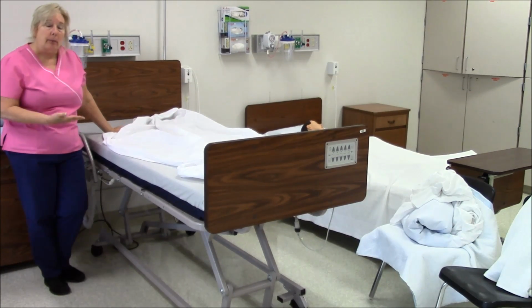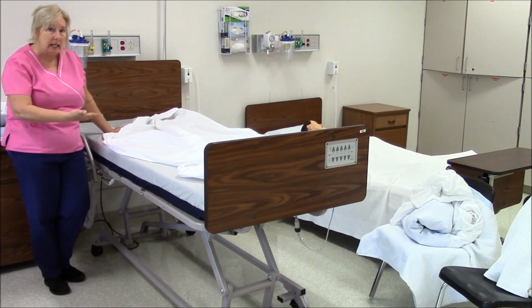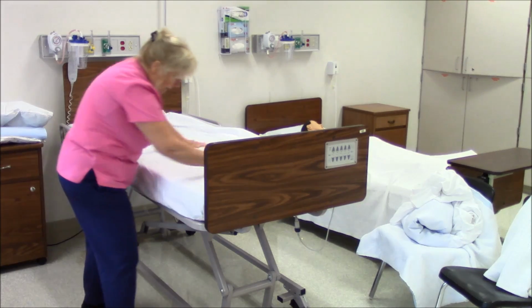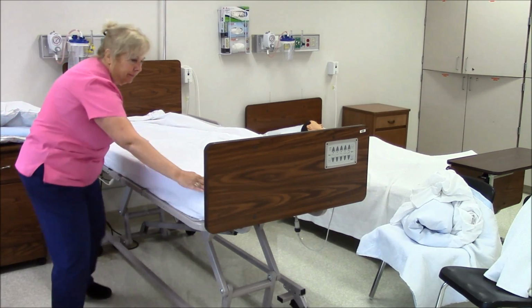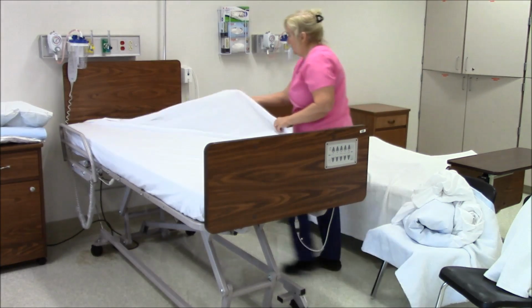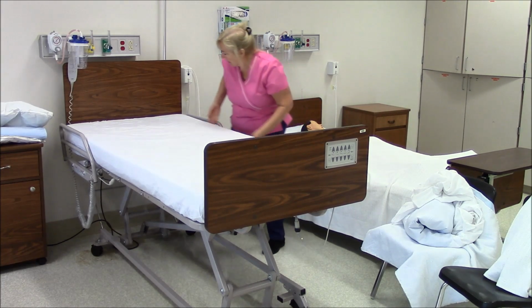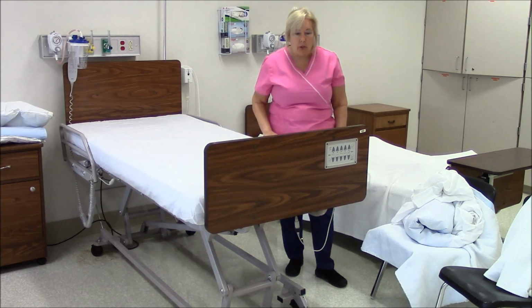It's also very important on your bottom sheet to try to get out as many wrinkles as you can, because many times you will see these wrinkles in your patient's skin. I put the first corner in. I'm now putting the second corner in. Before I move over to the other side, I am tucking the bottom sheet in. I now have all the corners. I'm pulling the middle of my sheet down just to get rid of any of the extra wrinkles. Okay? I am now done with the fitted bottom sheet.